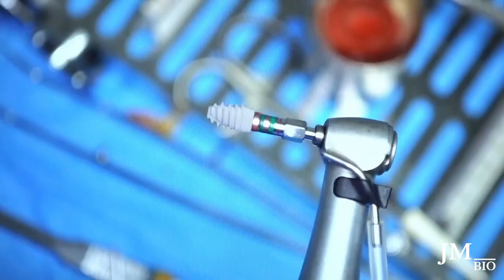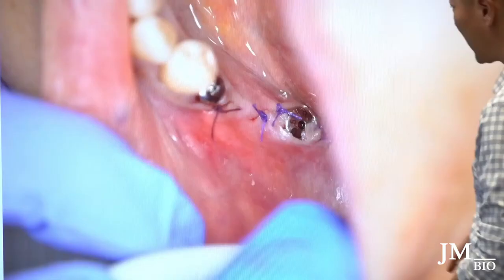Another one-day implant goes in. I hand-drive it down to depth. These are the healing abutments I placed. I added a little bone graft because it was a little thin in some areas, and there was some bone left from earlier that I'd mixed. I placed the bone graft and sutured up.